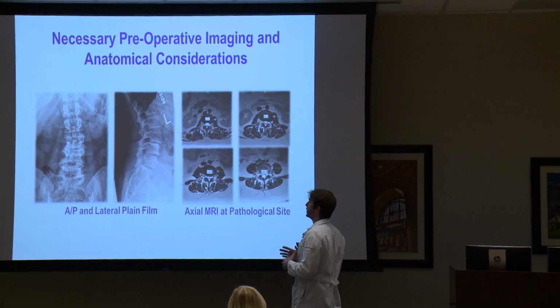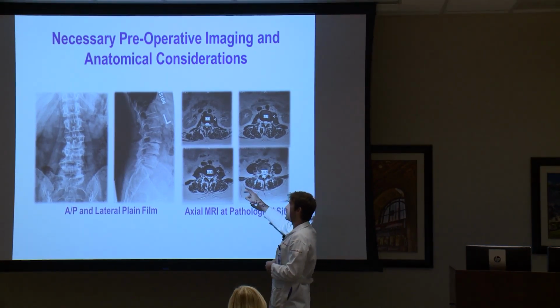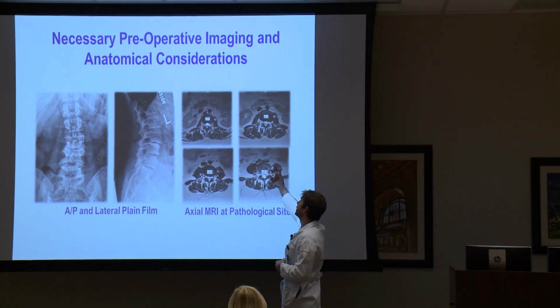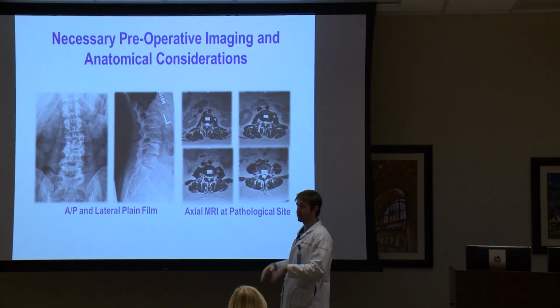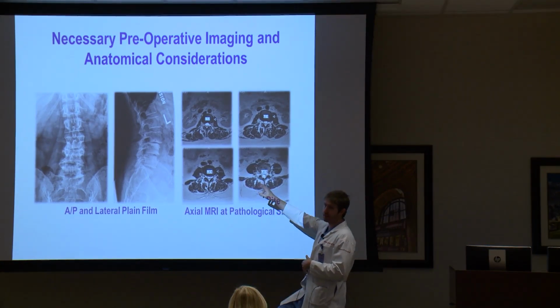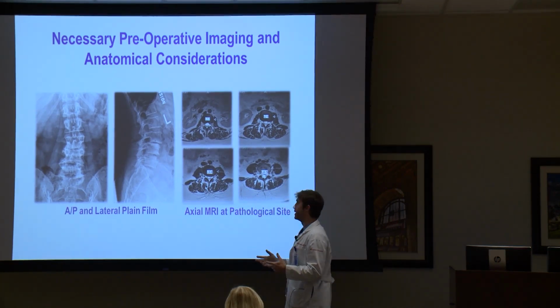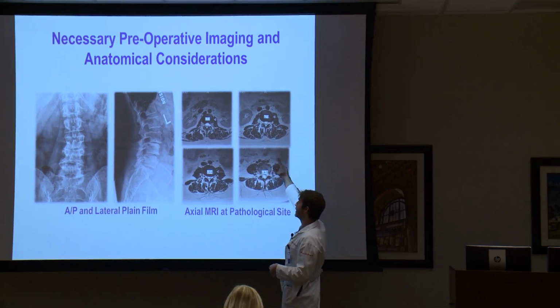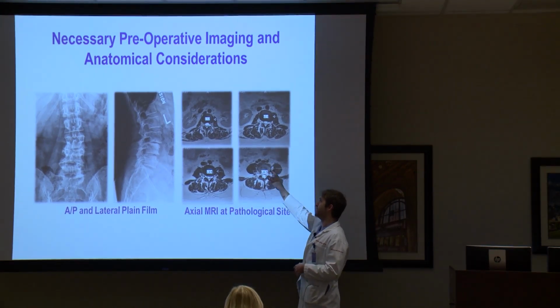The thing about MRIs is it'll show you not only the nerves and the discs, but it'll also show you if you can even do it on someone. If you're coming in from the side, and you can see these little arrows, this is how you'll be coming in. At 3-4 and 4-5, you have the psoas, which is the filet mignon in cows, because they can't stand up, so it's very tender. It's around the spine, and it's what allows us to pick our legs up like this. If you have that compact right here and laying down flat like that, then they're a perfect candidate. If you have what looks like Mickey Mouse ears sitting up here, that's a no-go. That means their muscles are a little bit anterior and there's nothing but nerves in your way.